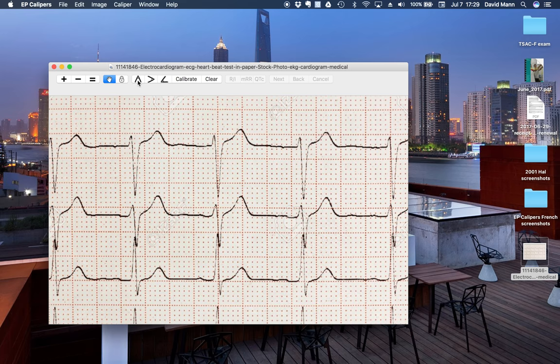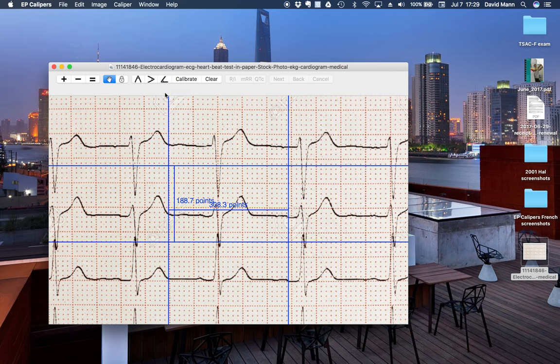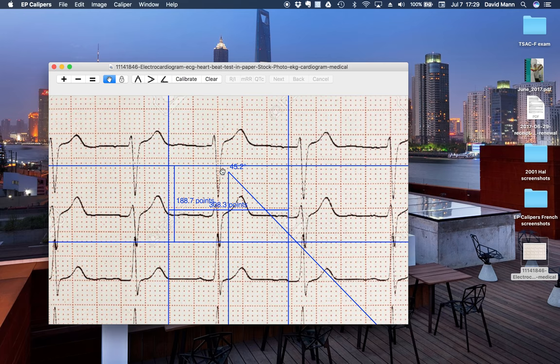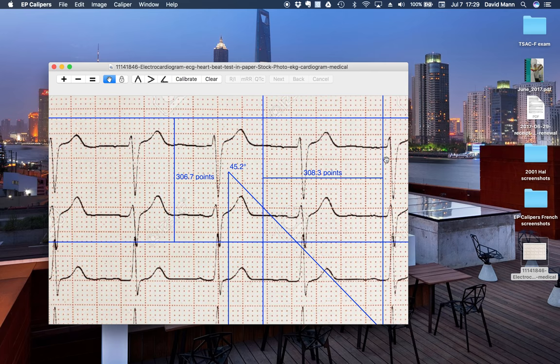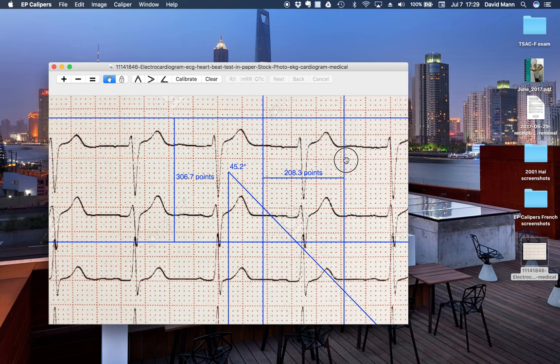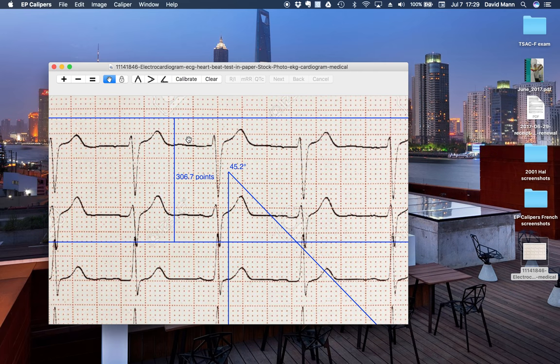And as before, we can add calipers: a time, an amplitude, and also now angle calipers that measure angles. And as usual, you can move these things around, highlight them, and delete them as well.